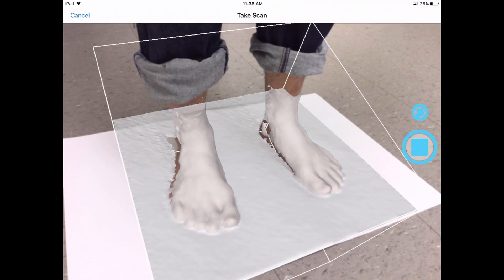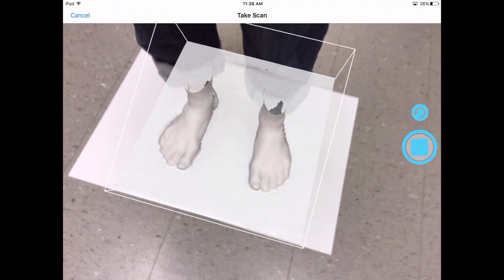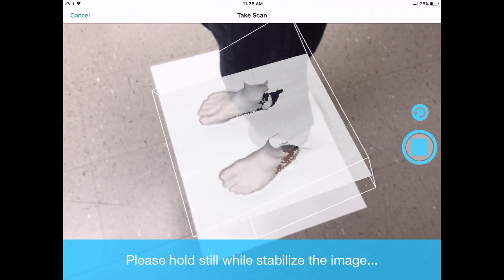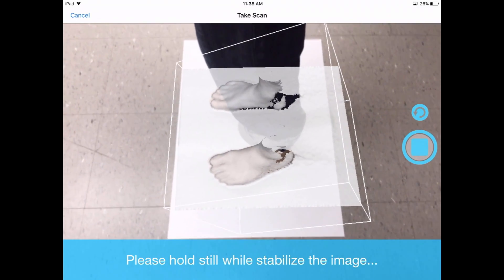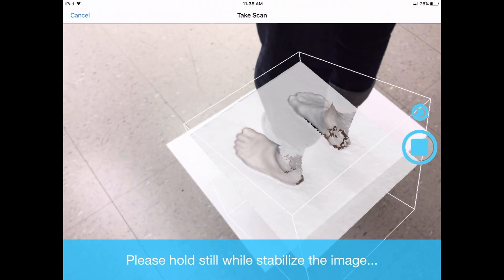Slowly move the scanner laterally and immediately you'll see everything start to fill in white. Then slowly move around to the back of the patient. It's important to note that as you're scanning, the feet should be placed on a solid color background.